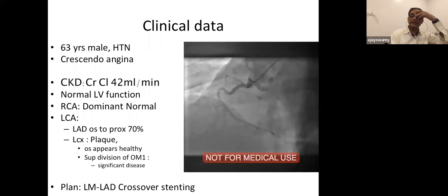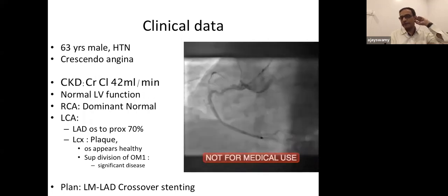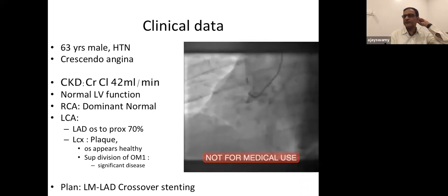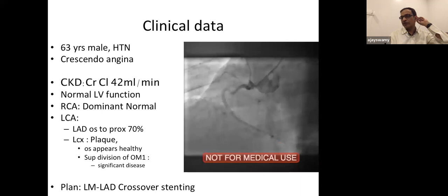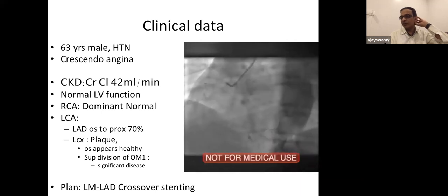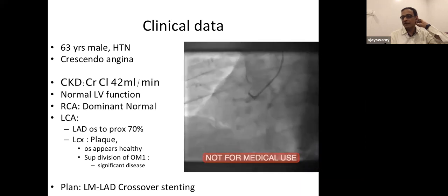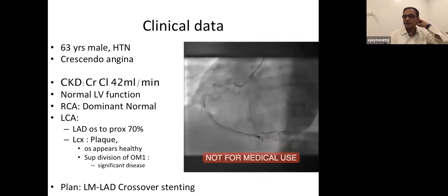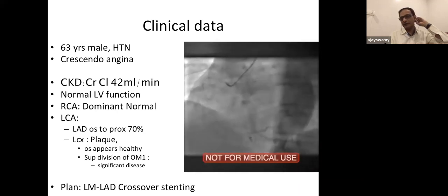We take out the imaging with the wire. We don't put the rota wire beside it. We first image with the wire. That wire itself, the majority of the time, will tell you what route the rota wire is going to take. The judgment is when you image with your original wire, see which side the wire artifact is coming. Is the artifact on the side of the calcium or on the normal side? That is the same route that the rota wire will take.